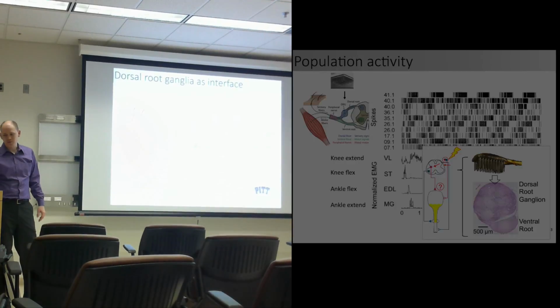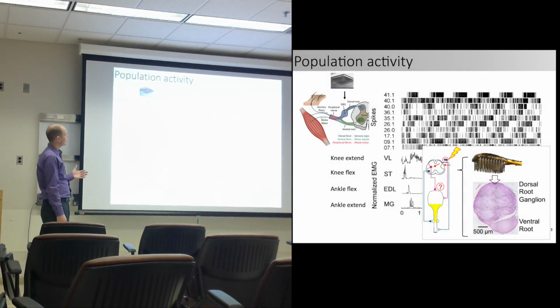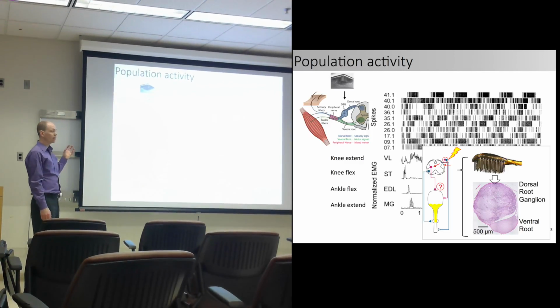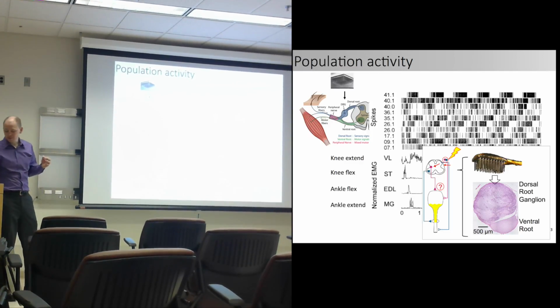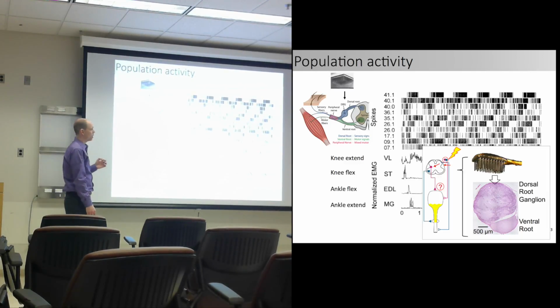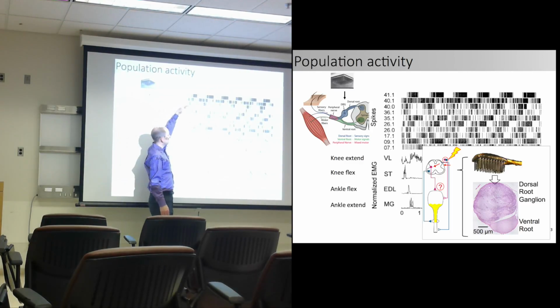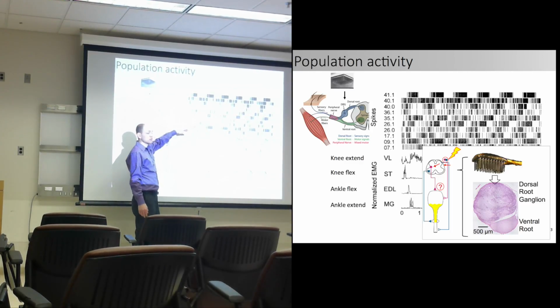As I'll discuss, improve the electrode technology. What's been shown in some studies in the past is taking a few or a lot of microelectrodes, very fine electrodes, putting them into the lumbar ganglia, and recording the population activity, say during locomotion. So here we have a bunch of recordings from individual neurons.